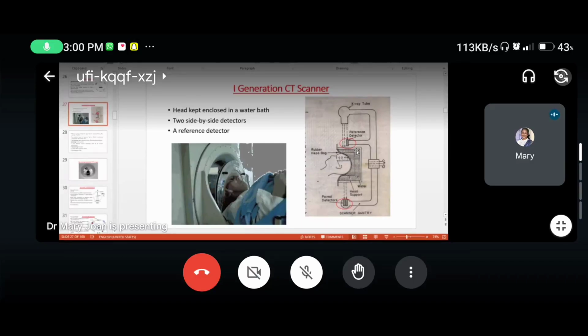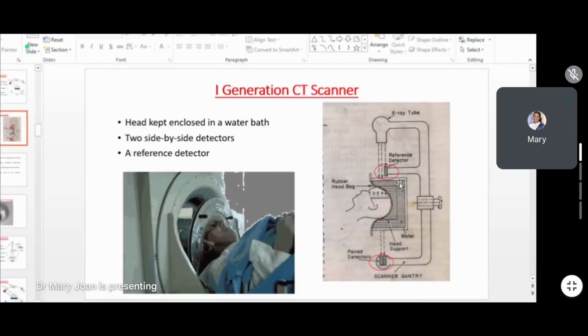One thing is there will be a slight reduction in the dose which is received by the patient, and another way there will be a slight increase in the skin dose, not very significant in the case of X-ray energies where it is 150 kV and all, but that will be more significant when the energies are higher, like what we use in radiotherapy, telecobalt, where there is 1.25 MeV energy or 6 MV energy, all that. Hope you understood.